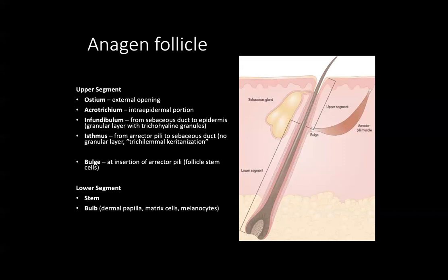Now, an epidermal inclusion cyst, which usually develops much higher up where you have the normal production of the granular layer, you'll see that in the cyst the lining has the granular layer, and then the center part has keratin that looks a lot like the basket weave stratum corneum. That's called the lamellated keratin. Whereas in a pilar cyst, you'll have more compact keratin that's more reminiscent of this trichohyalin production.